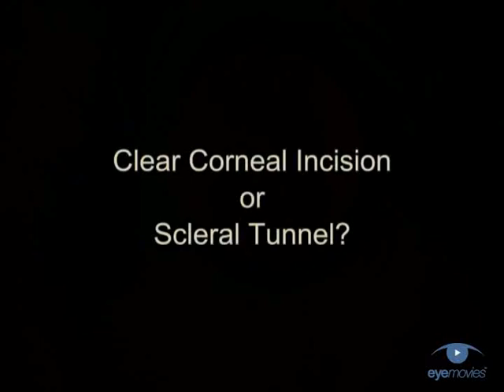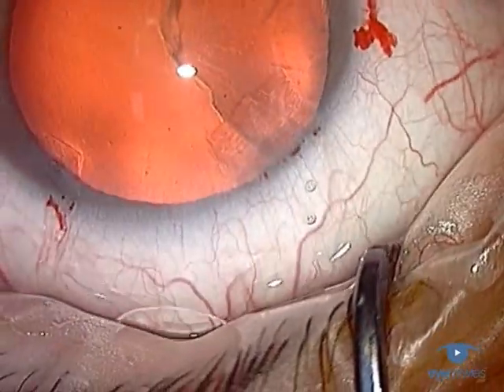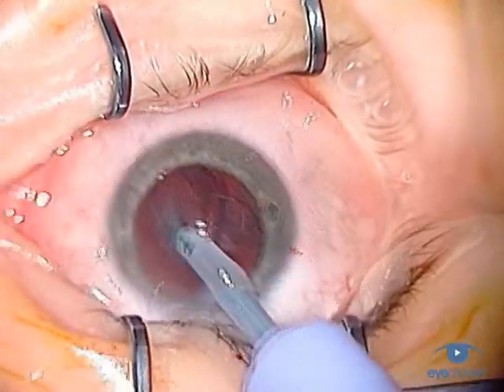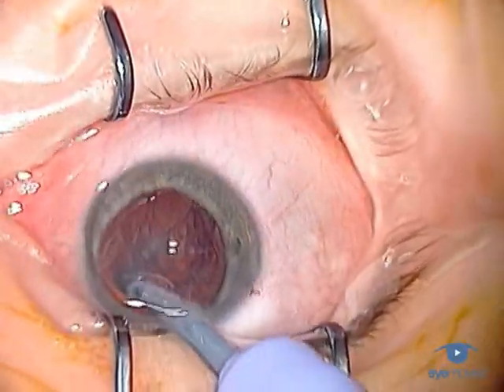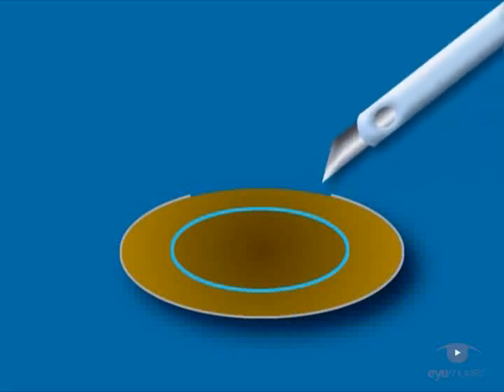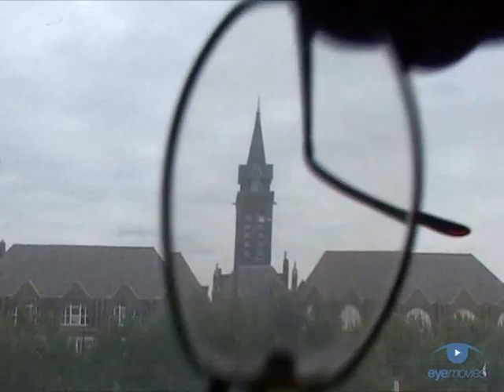When considering small incision surgery, the advantages of a clear corneal incision over a scleral tunnel include its speed of construction, operating in a bloodless field, greater maneuverability of the phaco probe within a relatively shorter tunnel, a steeper and more favourable angle of attack towards the nucleus, avoiding damage to the conjunctiva, and finally the use of the incision as a refractive tool for reducing corneal astigmatism.